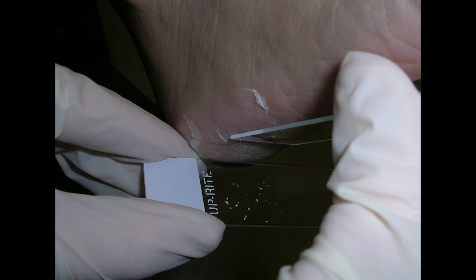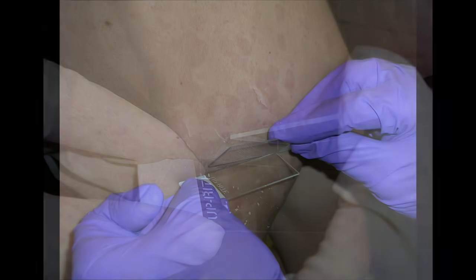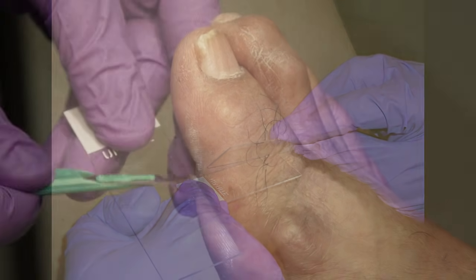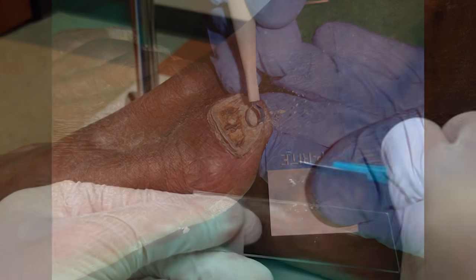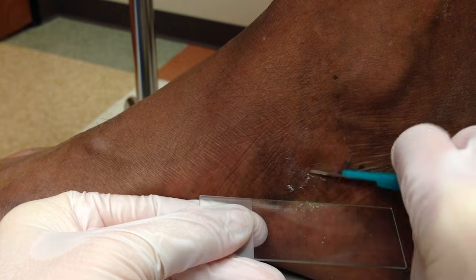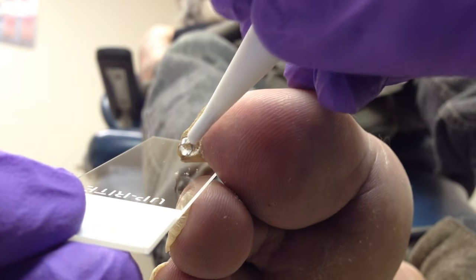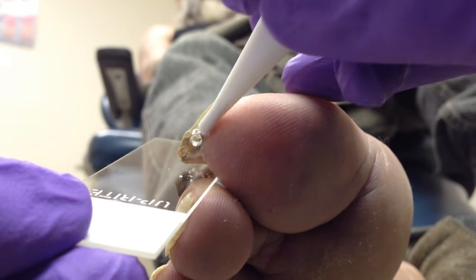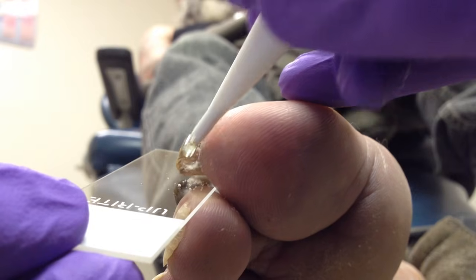The first step is to scrape skin from the affected area onto a microscope slide. This can be performed with the edge of a slide, a scalpel, or a curette. Scrape the edge of the lesion to maximize the yield. A sharp skin curette is a very useful tool for scraping subungual keratosis or nails looking for onychomycosis.